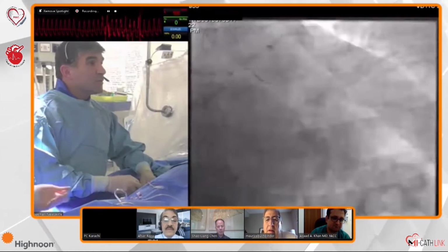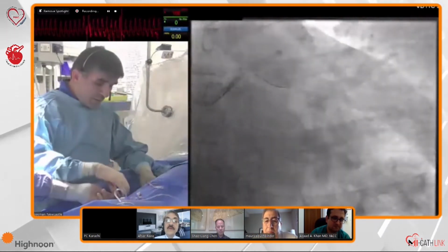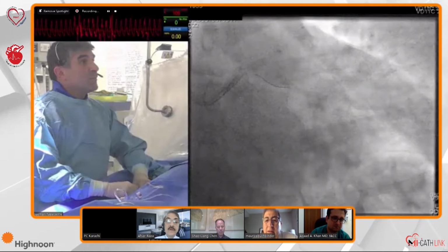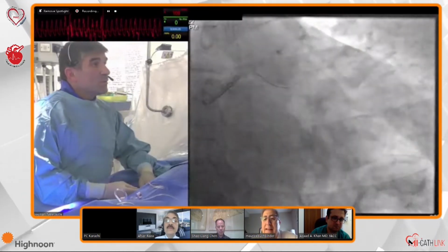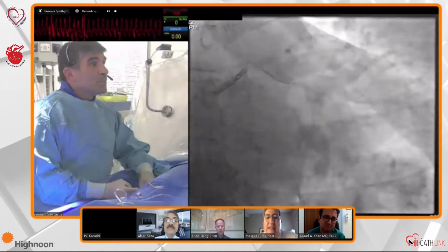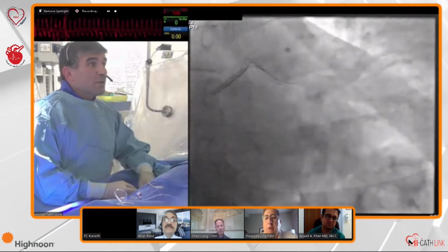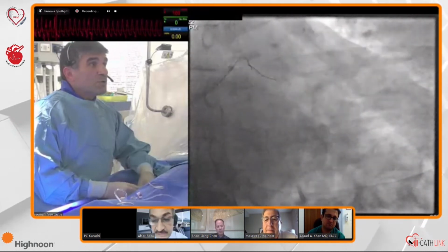So here, I'm just going to make sure that when I take the soft wire out, the circumflex is okay, and then I could take the wire out. And maybe at the end we will talk about IVL, when, where, and how, in addition to potential. Yes, this is important, to be honest.